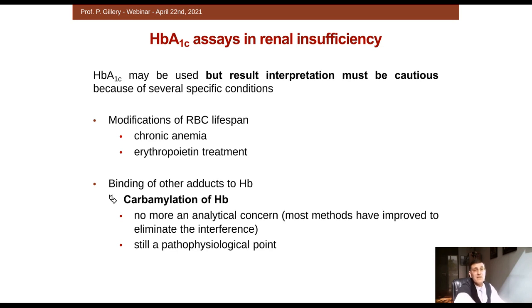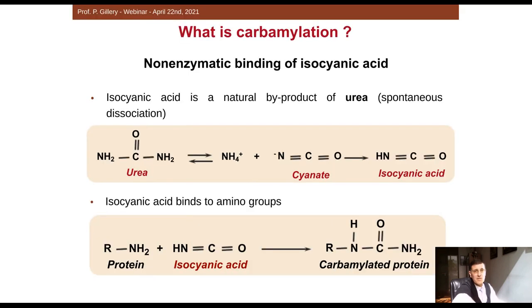Another phenomenon is the binding of other adducts to hemoglobin. And this is a case of carbamylation of hemoglobin. For many years, carbamylated hemoglobin was an analytical concern because it interfered with many methods. But this is no more the case, and now most methods have improved to eliminate this interference. But this is still a pathophysiological concern.